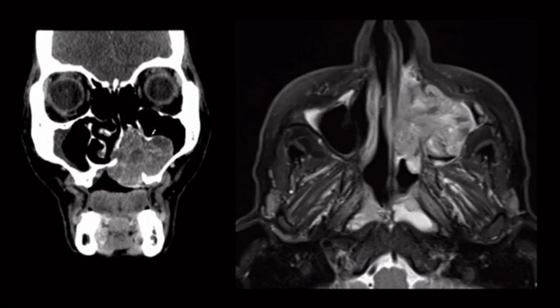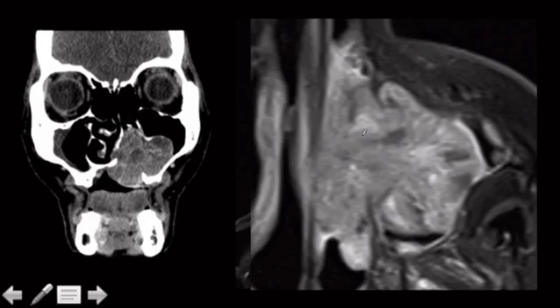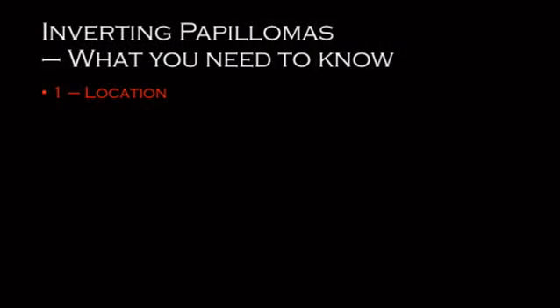We've got a big mass here expanding the maxillary antrum, and we've got an MRI. This is the characteristic feature — see how it sort of looks like a brain? It's got what you might call white matter and gray matter, a cerebriform appearance. That's a buzzword. This is an inverting papilloma.